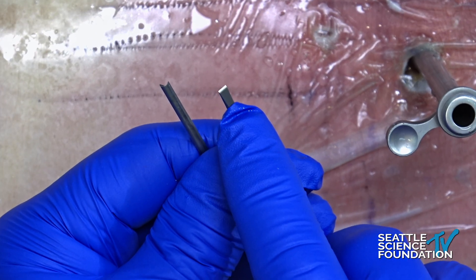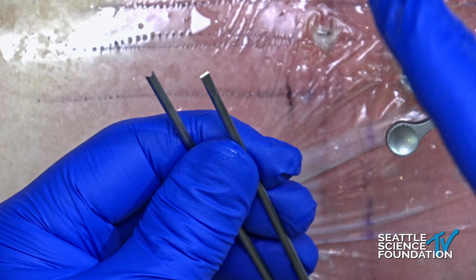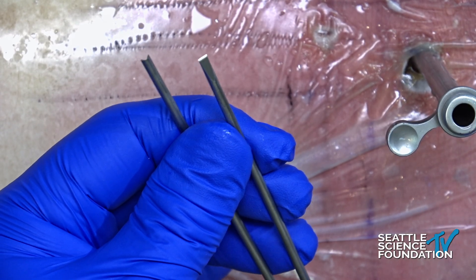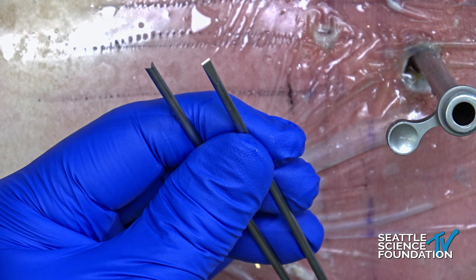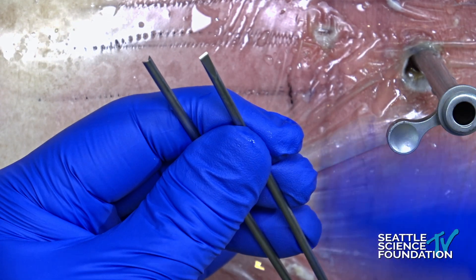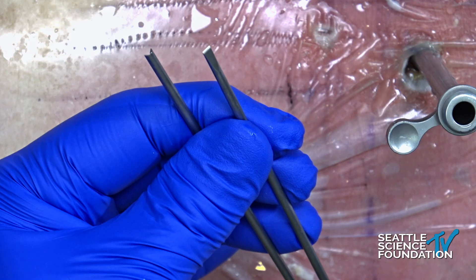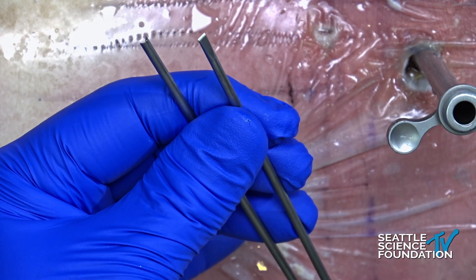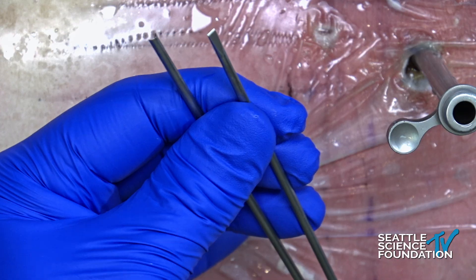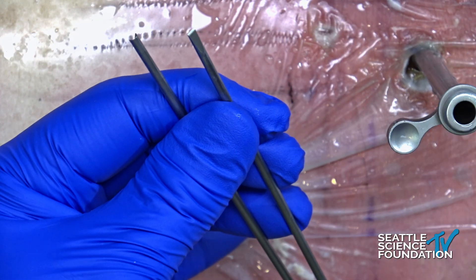With the chisel tip you can make a dotted line on the lateral recess, score it, and then go in with a Kerrison and bite off a lot of recess in one big chunk of bone. If you do this where the ligamentum is the last bit attached to the lateral recess and thin it out with a high speed burr, you can score it like a piece of glass, break it off, and now you've got a handle for the ligamentum.